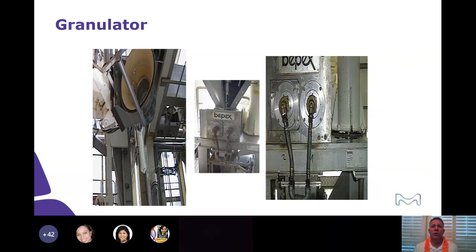And the granulator, and this is the cool part. We started granulated media back in the 60s, I believe. And before that, we had the first patent ever on media. The way the granulator works is this little device. The media comes down this funnel, and it goes right into this machine. It's called a BPEX. These 2 barrels have little pits and a matching barrel, so the pit matches the little part that comes out of the other granulator. And when you push the media down, it forms little granules. So it's not powder, it's actually more like sugar or coffee.